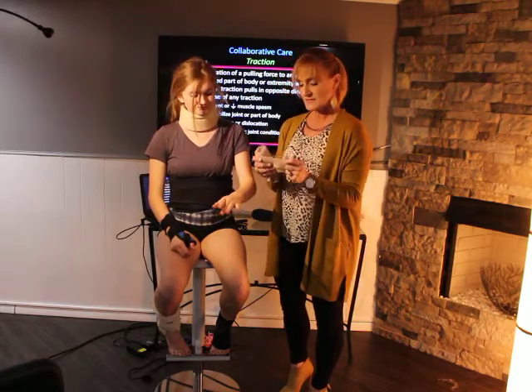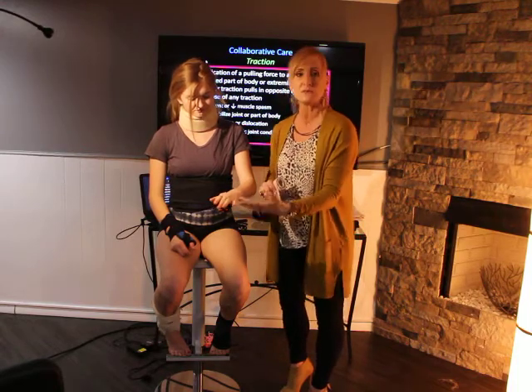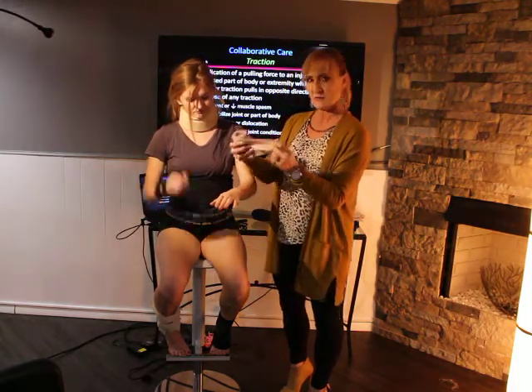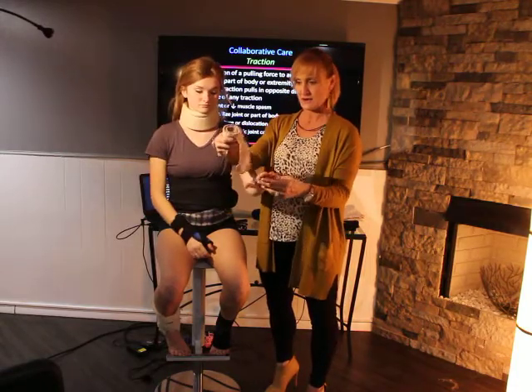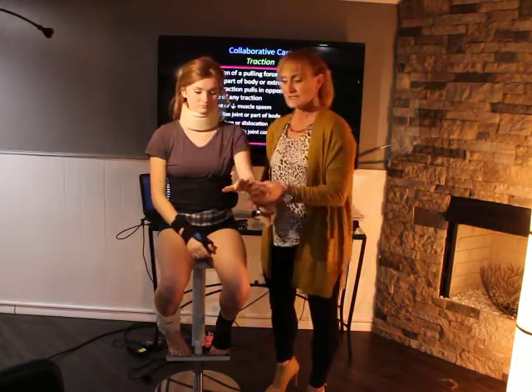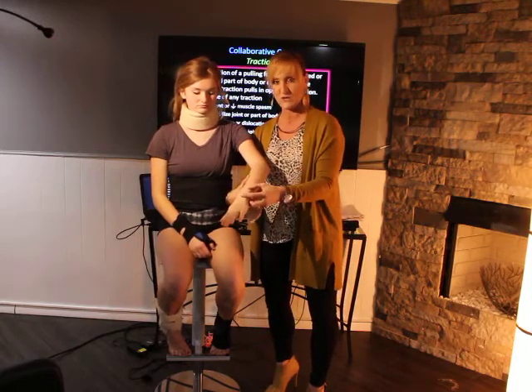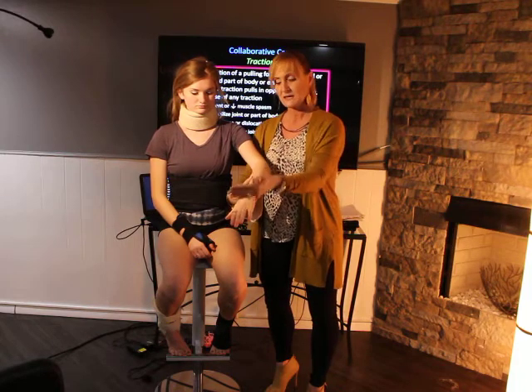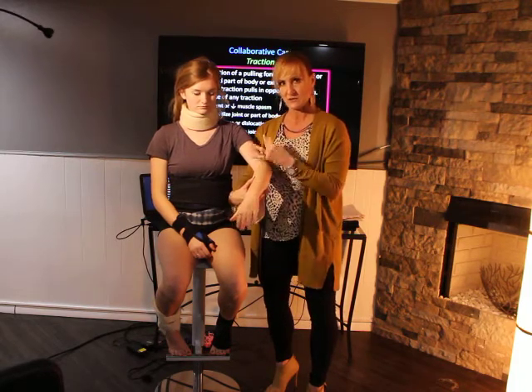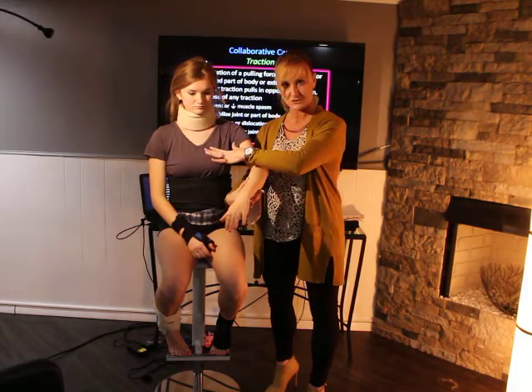So this is how you put this on both a wrist and an ankle. You do the same thing for a knee, but I want to show you how to do it because you can't graduate from nursing school not knowing how to put on an ACE bandage. So let's say that the wrist here is the location of the injury. So I'm going to want to provide most support right here, keeping in mind I want the swelling to flow proximally and more towards her core.